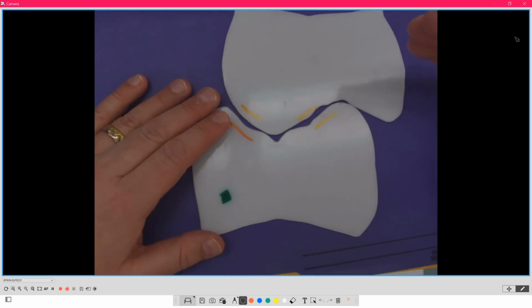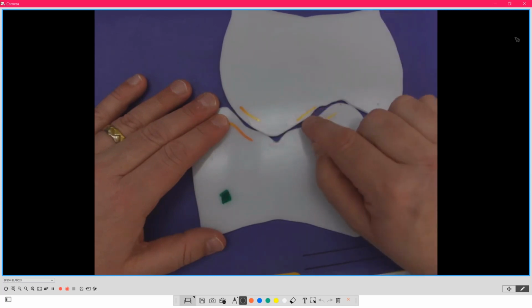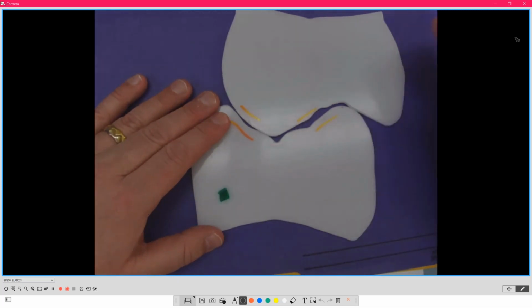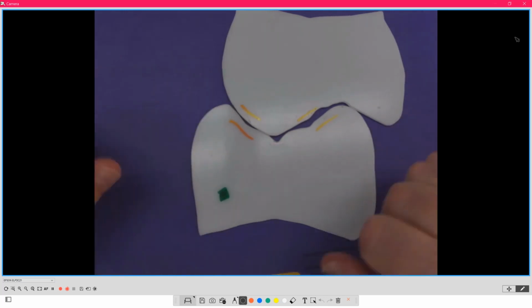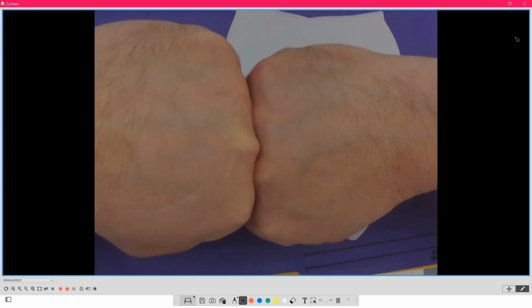So what VITA has done is they have that little bit of wiggle room and that little bit of freedom, okay? And then they've also incorporated gapping so that it's not super tight, and you have an overlap here. So we're used to setting denture teeth that, I'll say 20-degree teeth, are quite knuckle tight.